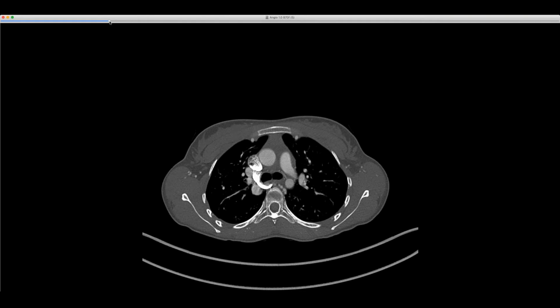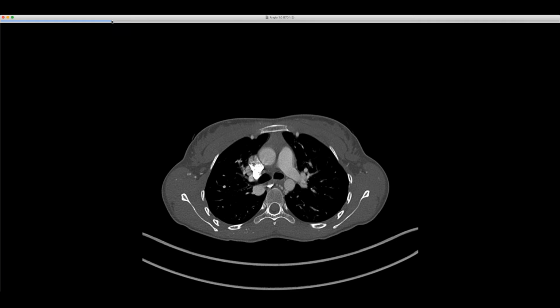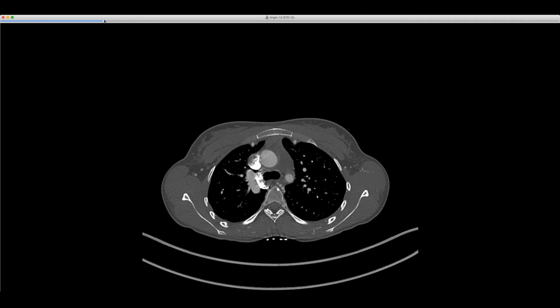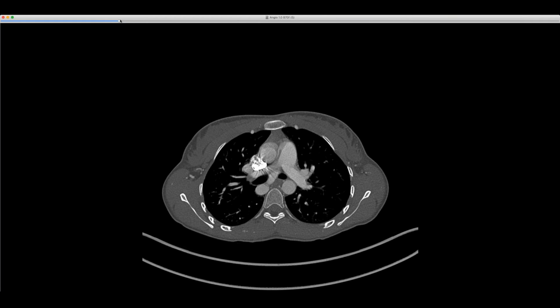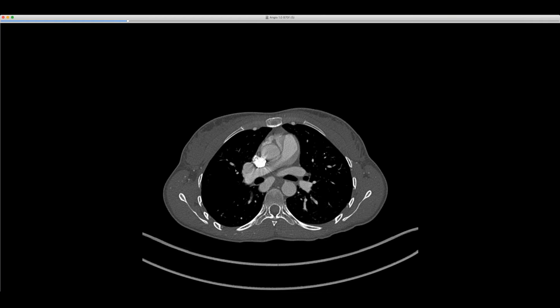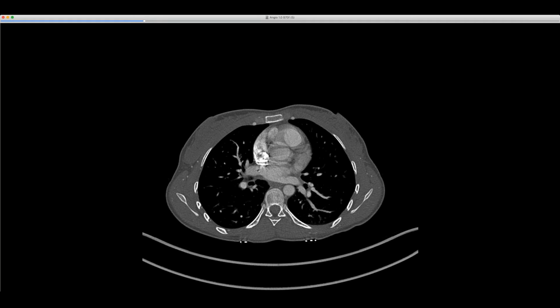And then I thought that it was going to be a variant of anomalous pulmonary venous return draining into the azygos, but it's actually not. Here's the large common vein that picks up some venous drainage from the other side as well. You can see right here it's picking up some left upper lobe pulmonary venous drainage, and then it drains not to the right side but to the left side, back into the left atrium.